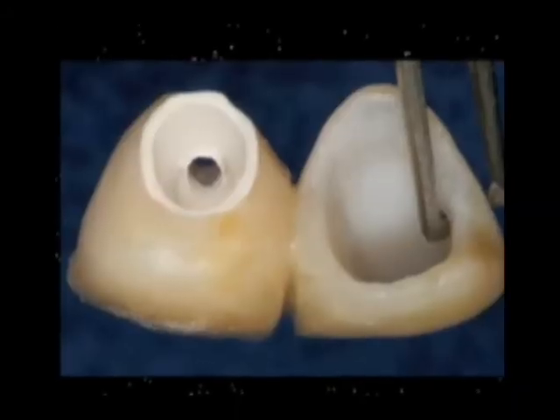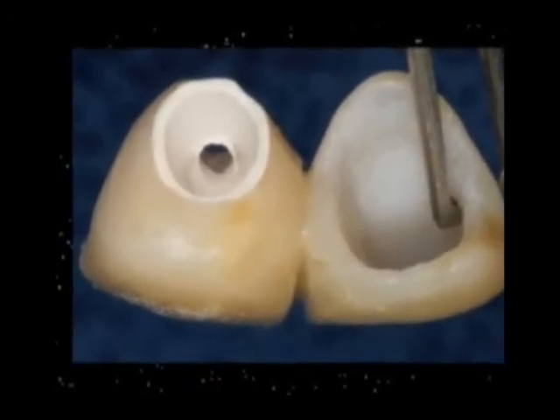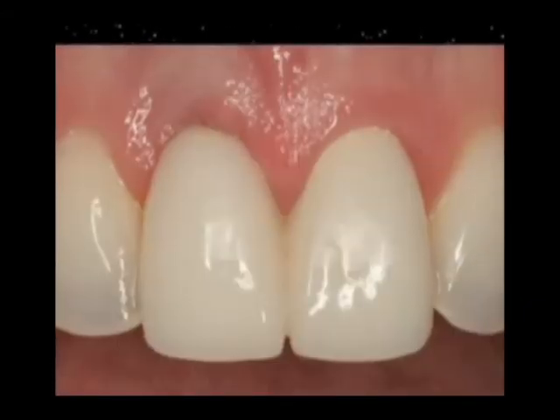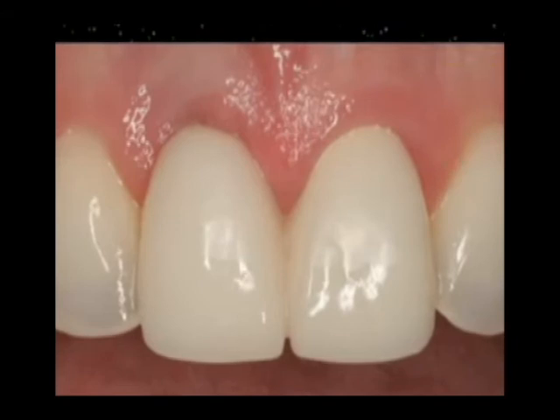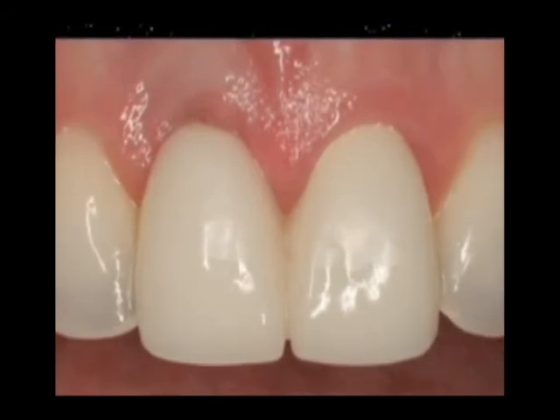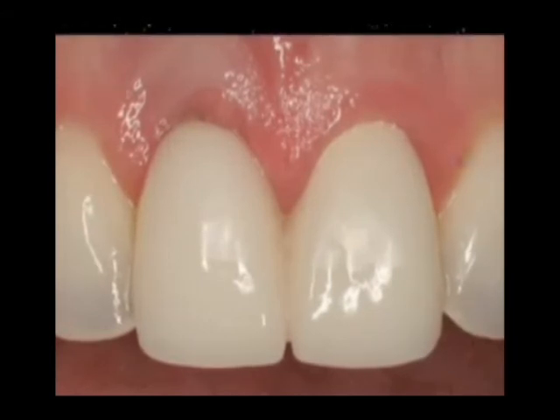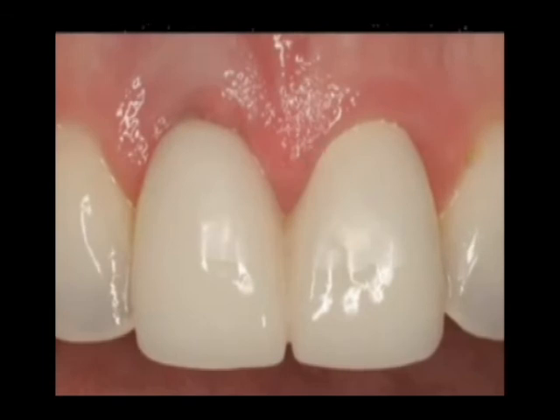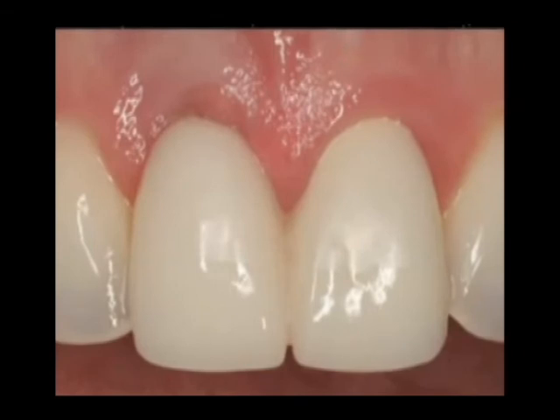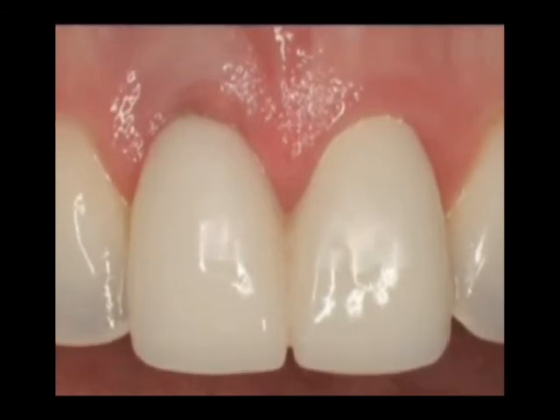The temporary restoration is the key to the success for the aesthetics of the restoration, because the restoration is not only about the temporary crown and the final porcelain crown, but it also is about the gingival contour and the health of the gingiva. So when you're able to place the implant and immediately put a temporary restoration on the implant, you're immediately able to contour and guide the tissue during the healing process to look the way that you want it to look. And of course, we want it to look like the adjacent tooth gum tissue.